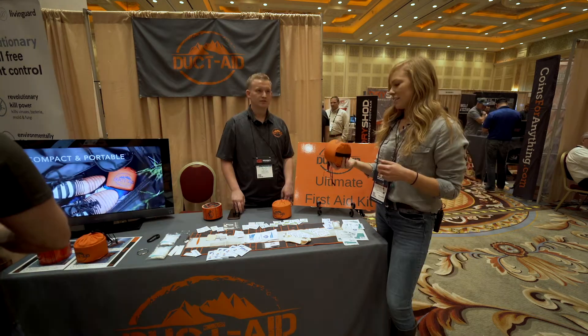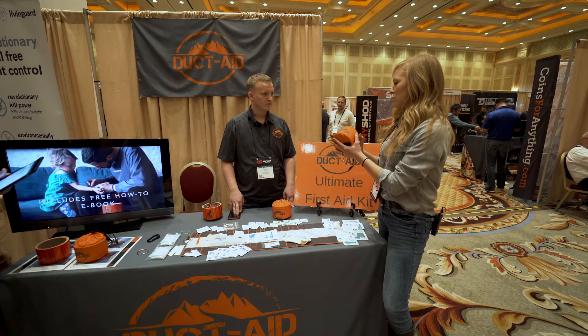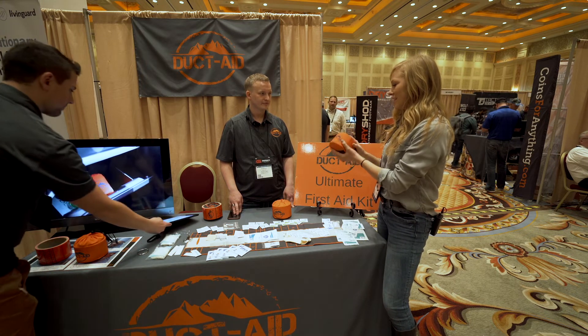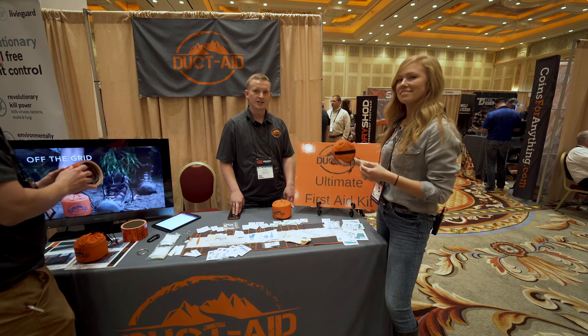Very unique product. I know it's really important for guys going on backcountry hunts — they get concerned about whether to take their first aid kit because of the extra weight. How much does this weigh total? So this is one pound, four ounces total. It's very lightweight and easy to keep inside your kit.